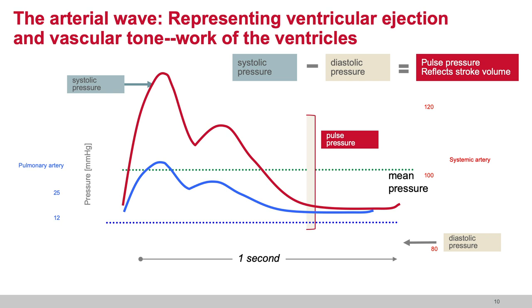At the bedside, we talk frequently about the mean arterial pressure, which is very important in terms of maintaining continuous perfusion, but which in general is a mathematic calculation looking at the time spent in systole, the time spent in diastole, adding those two together and dividing them by total time. So at the bedside, our monitors actually calculate that time and they will derive a mean arterial pressure that gives us a very particular number that won't be the same as it is if we are doing a simple calculation on a calculator. But these concepts are so important because the mean pressure is the value which actually helps us to understand continuous perfusion through the lung and at the cell.